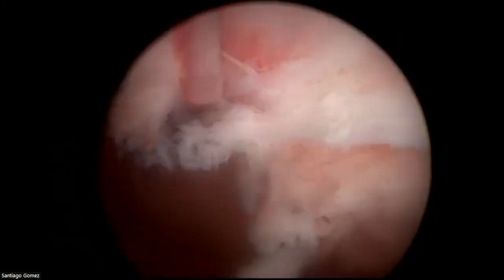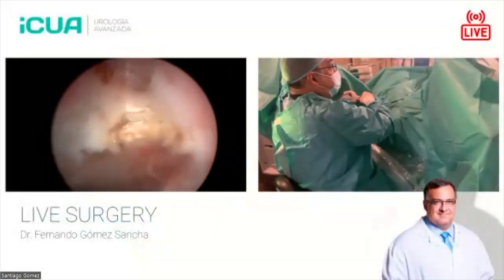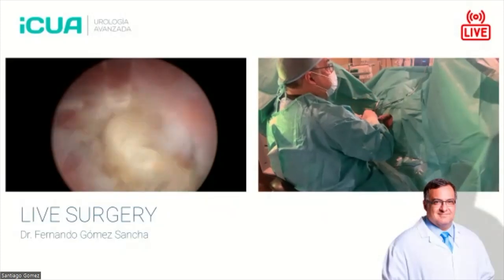Let's repeat these steps starting again here. This is my white line on the other side. So initially, I'm going to deepen the incision a little bit. This is an access incision.